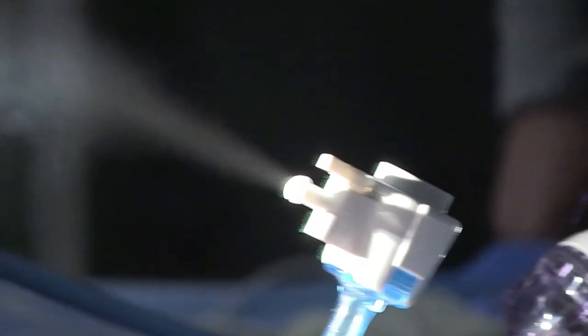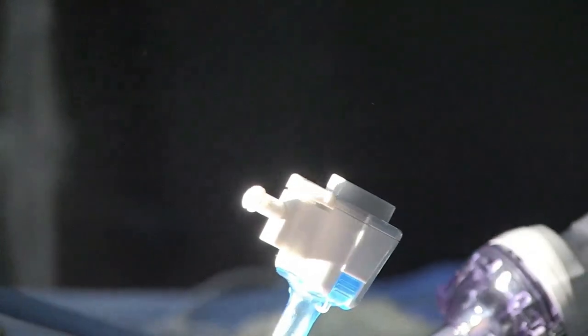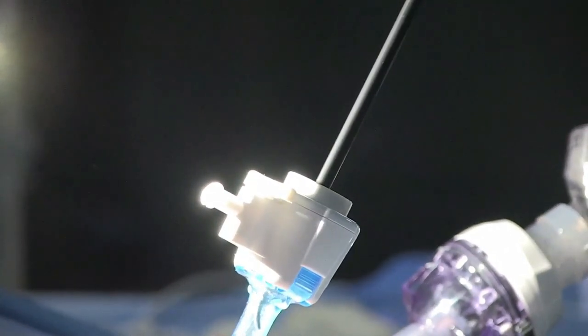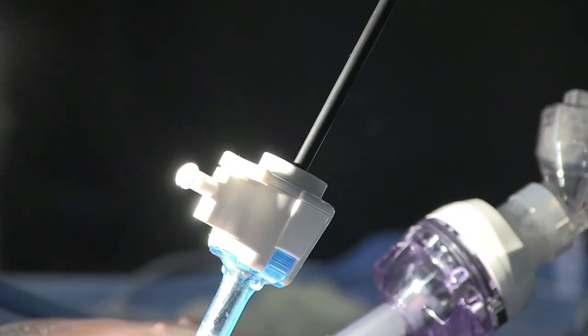This video illustrates the gas jet streams that occur through trocars during laparoscopic surgery. The stream due to opening taps to vent smoke is well understood, but what may be harder to appreciate is the gas leakage that occurs with instrument insertion and removal.